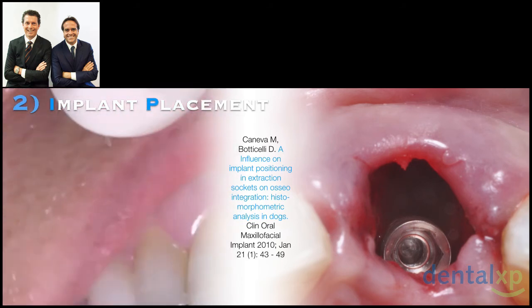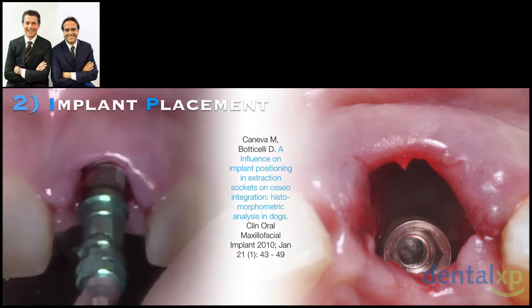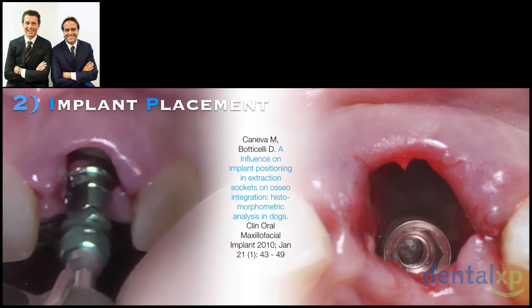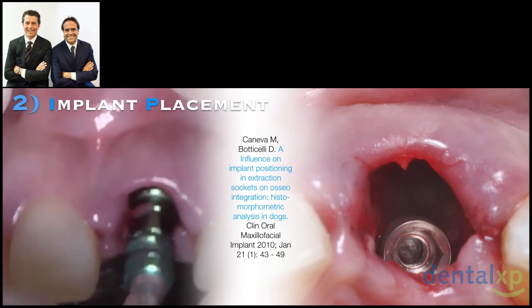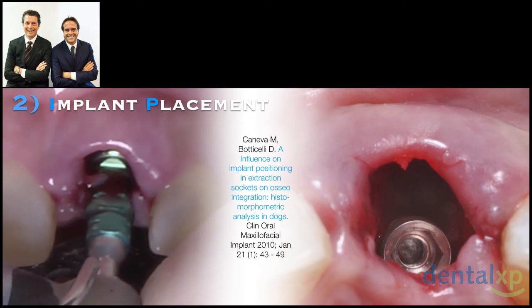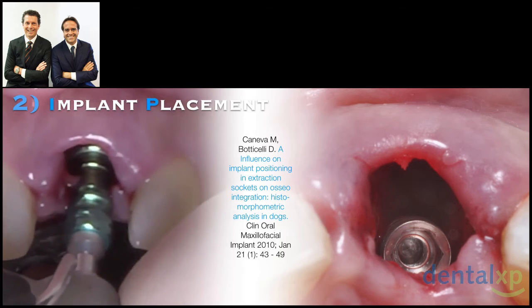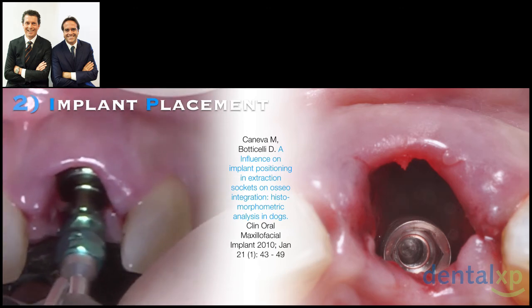So the implant must always be guided by the prosthesis. Yes. Okay. And now we see that we place our implant, we have this gap to manage. Let's see how we manage this gap with the surgical veneer graft. And once again we should ask ourselves which is, in this specific case, the best way to manage this gap, preventing a buccopalatal collapse of the post-extractive socket.